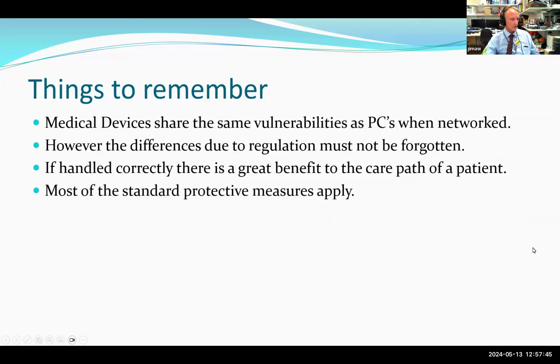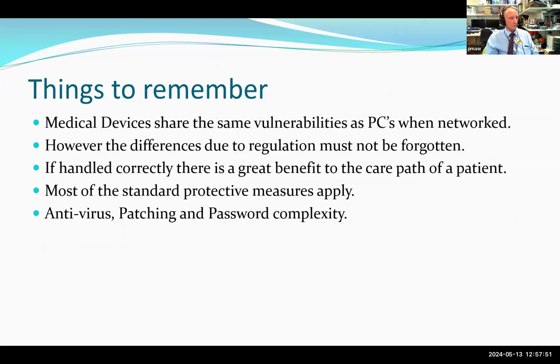A lot of the standard protective measures apply, except where they don't, so that you don't break the CE certification. So, things like antivirus you can use in some cases, patching, obviously you do when you can. And when you've got passwords on devices, you need to make sure that they are complex.